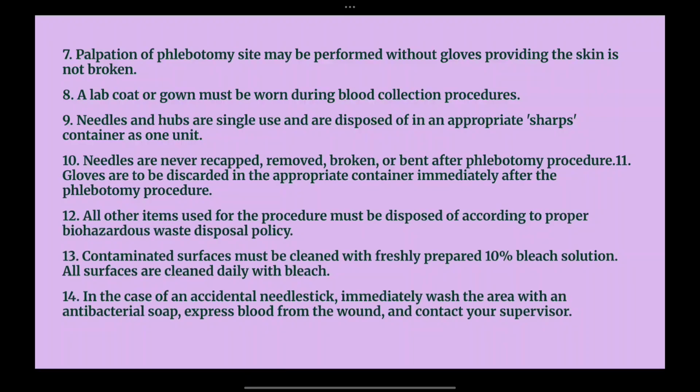Now the 12th point that you have to notice: all other items used for the procedure must be disposed of according to the proper biohazard waste disposal policy. There is a biohazard waste disposal policy that is followed internationally, and it is essential to maintain proper disposal of waste in order to avoid complications later, because the sharps might cause injury to the people who are going to segregate and throw out the waste.